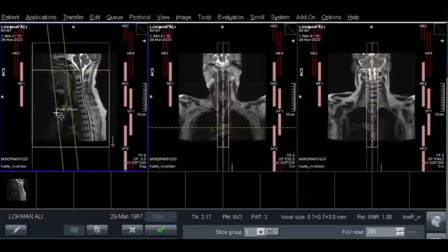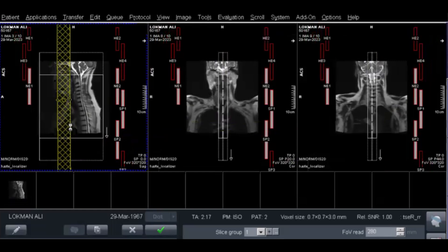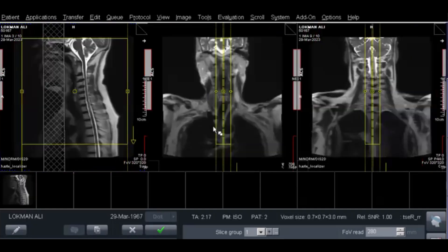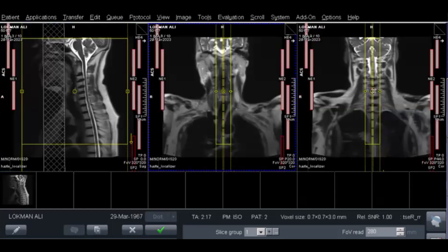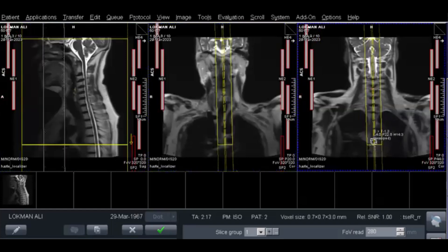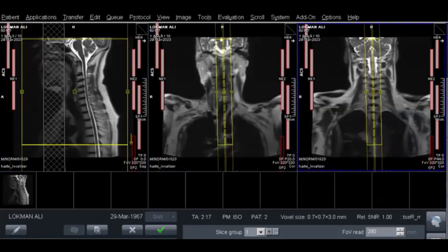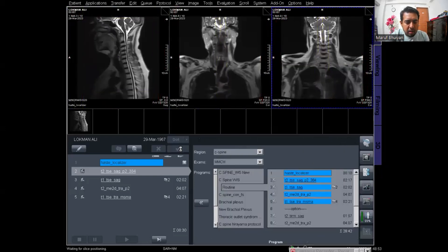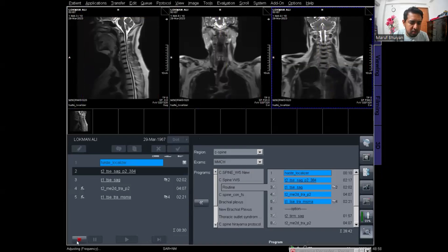First, adjust the saturation band parallel to the cervical spine. The saturation band is used to reduce artifacts from respiration or any other movement. Then plan the sagittal slices parallel to the spinal cord — there are 13 slices and the slice thickness is 3. I am applying this planning. The T2 sagittal planning is complete, and the T1 sagittal is also complete.